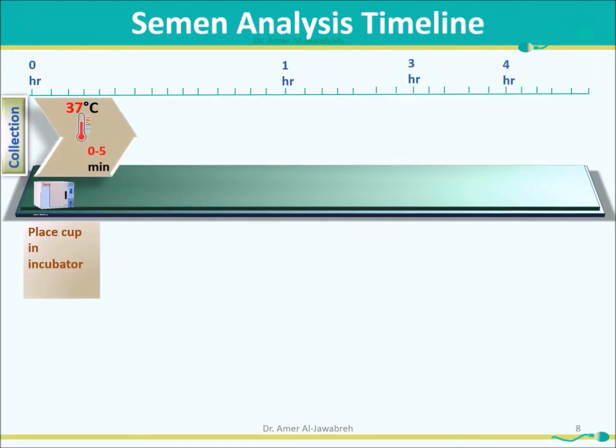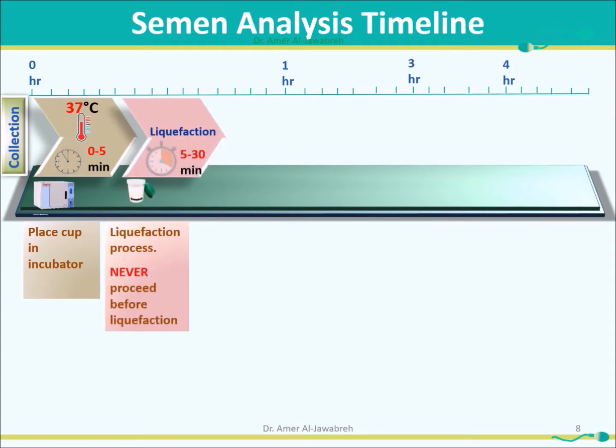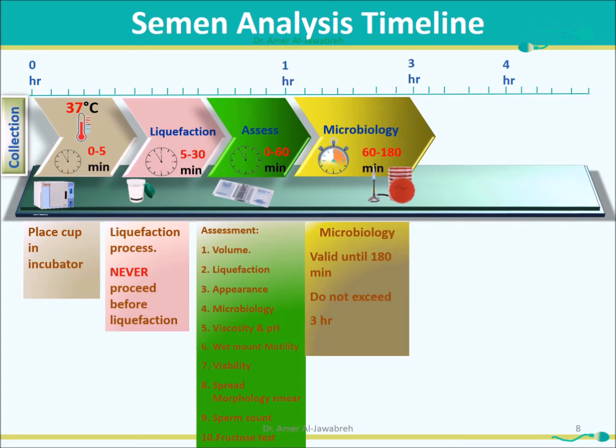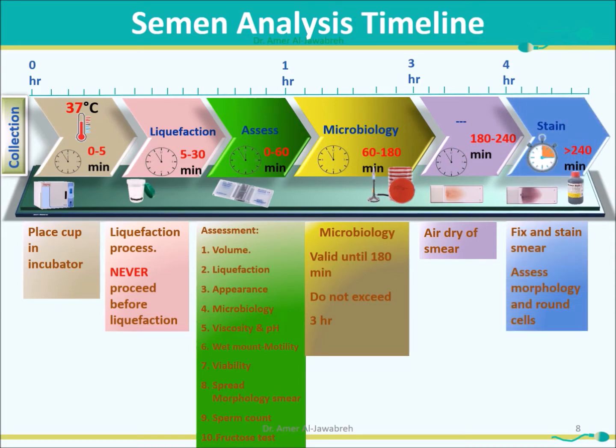Semen analysis timeline. Collection. Place in incubator. Liquefaction. Assessment of several parameters. Microbiology. And stain for morphology assessment.